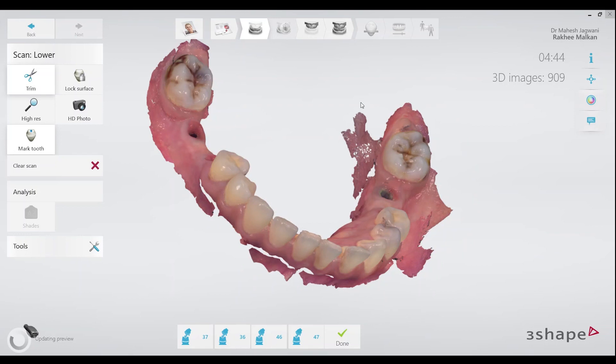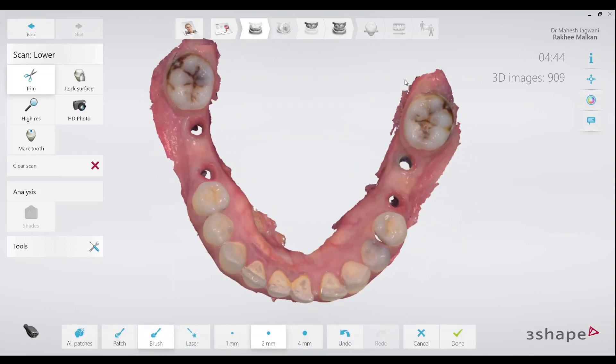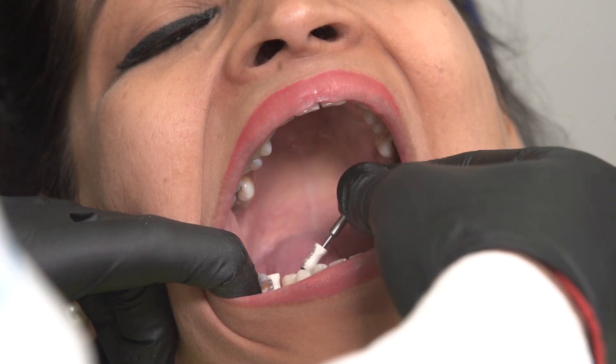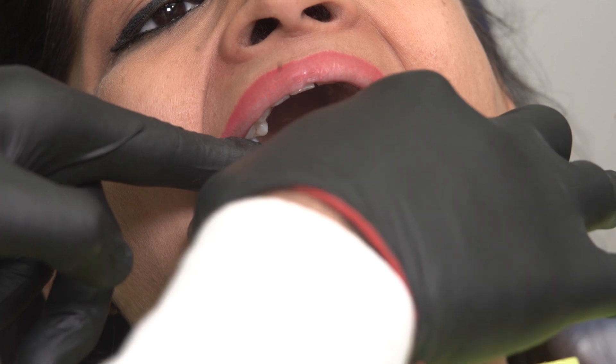We now move on to the next step of the implant level scan sequence, which is the scan bodies. These are the scan bodies from Biodenta which I am going to use for this case. They are just used like any other implant components — you can pick them up with a hex driver, place them onto the implants, and tighten the screw.